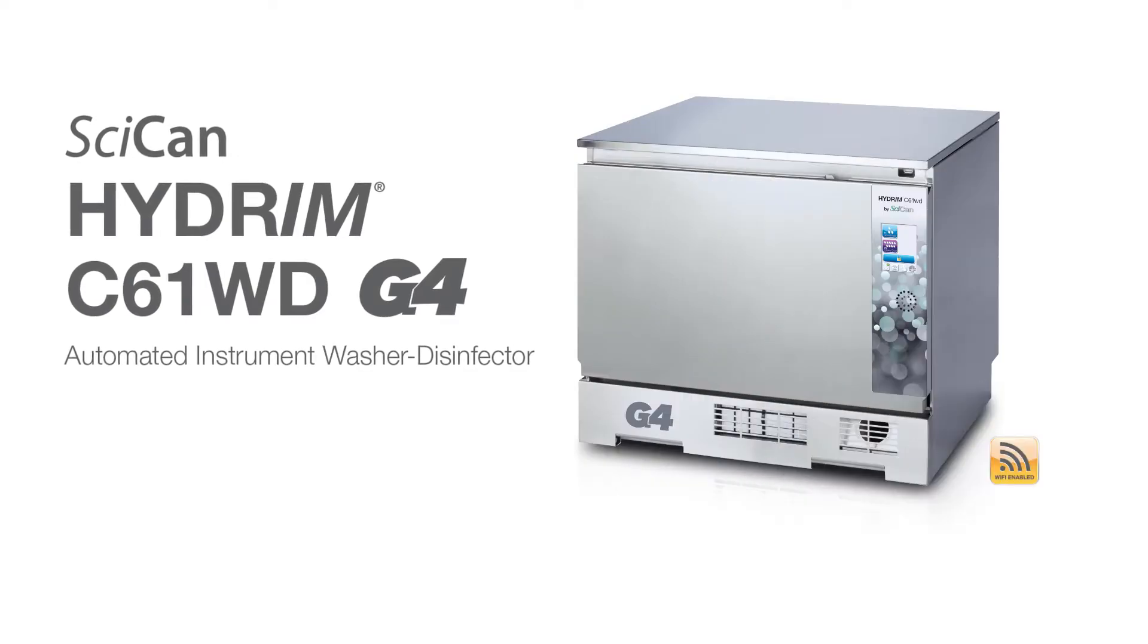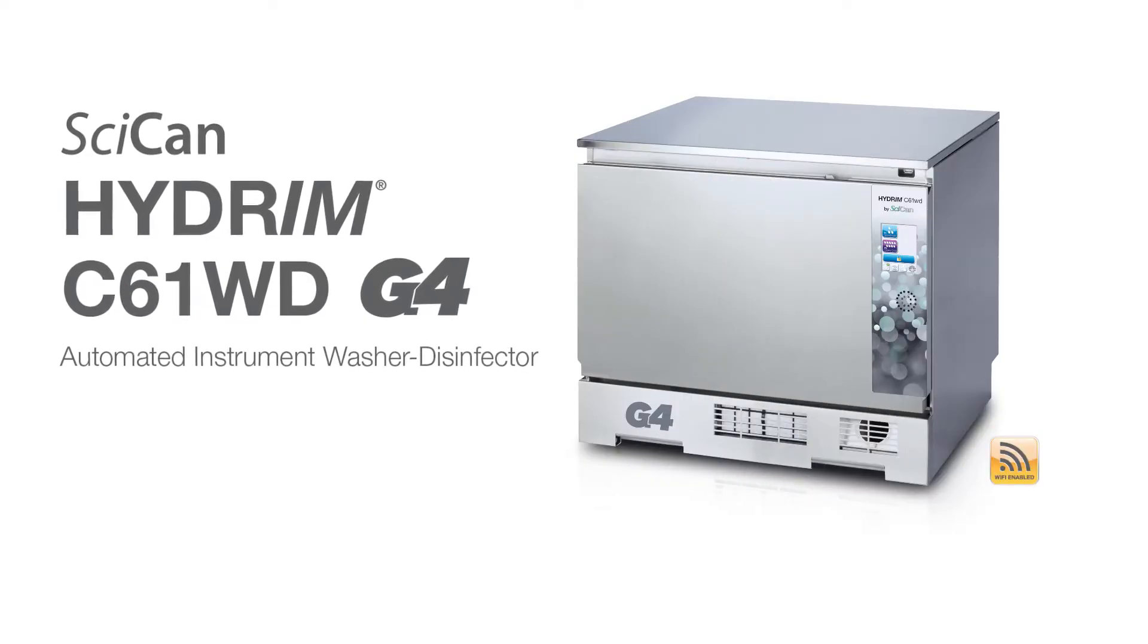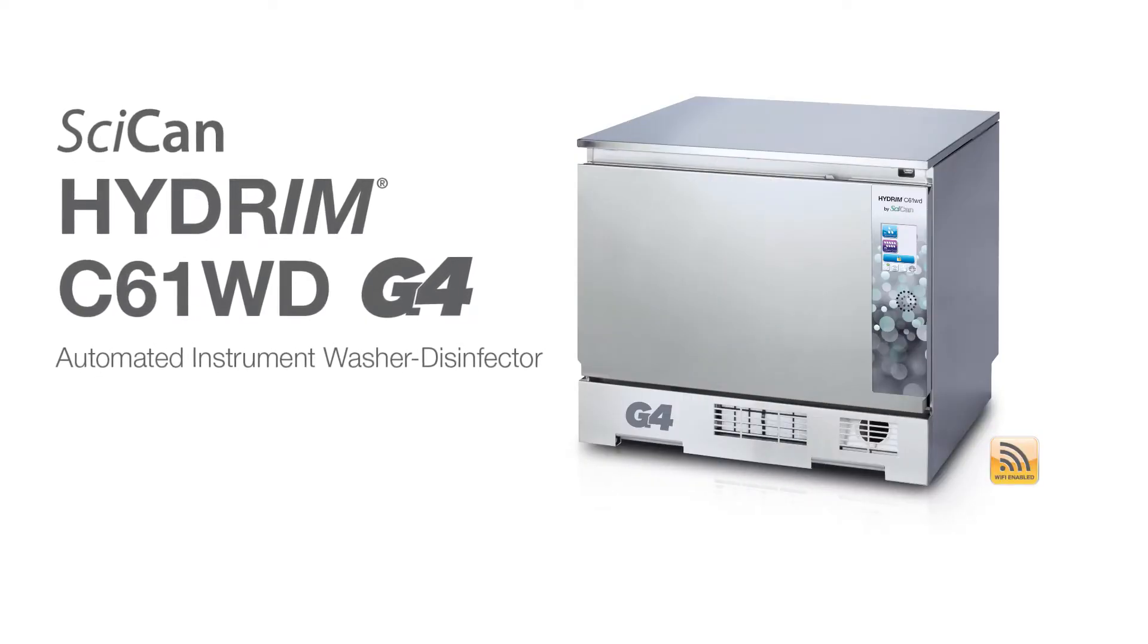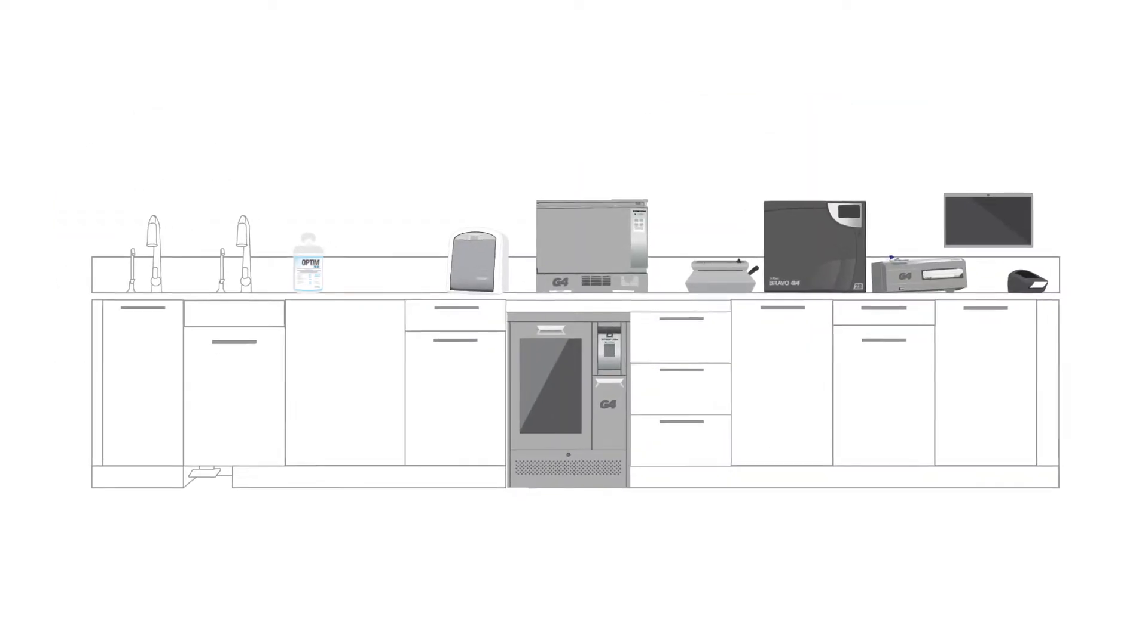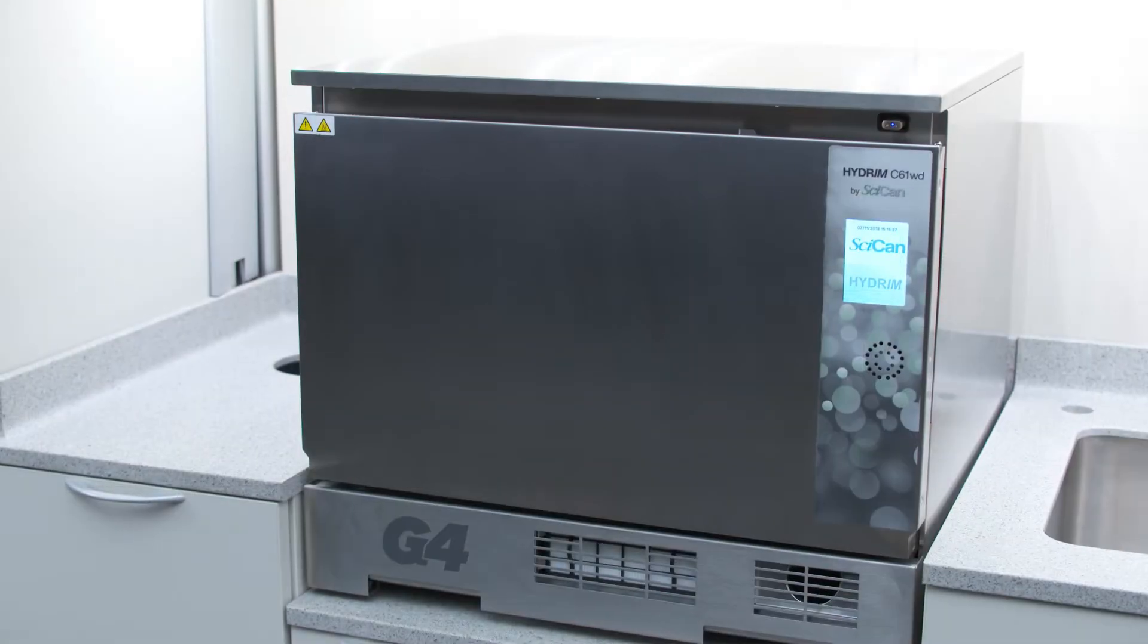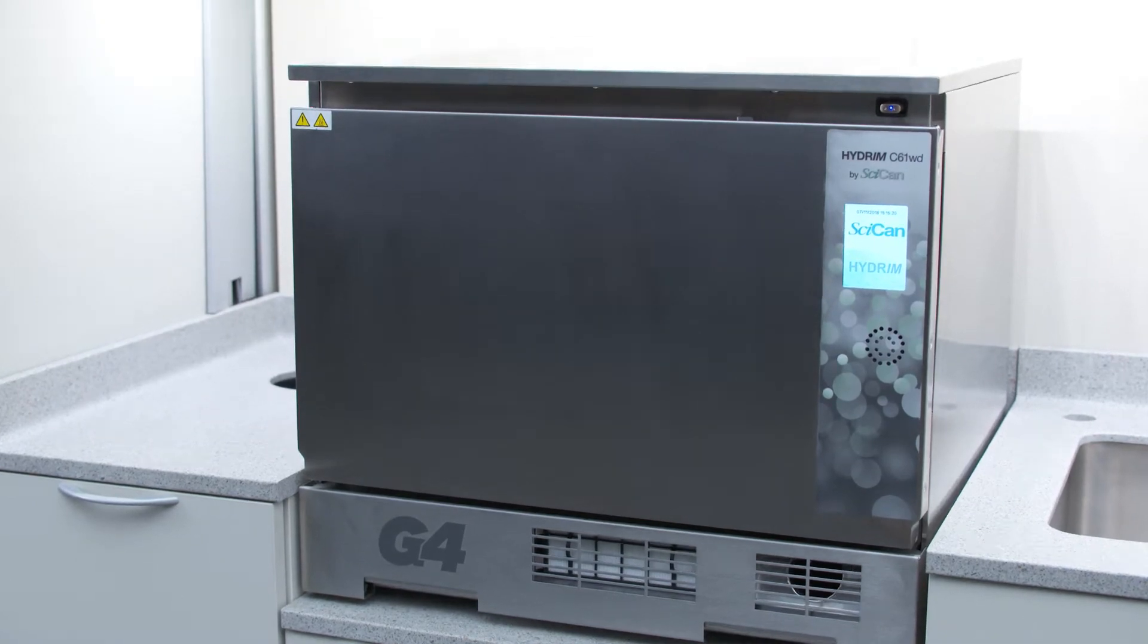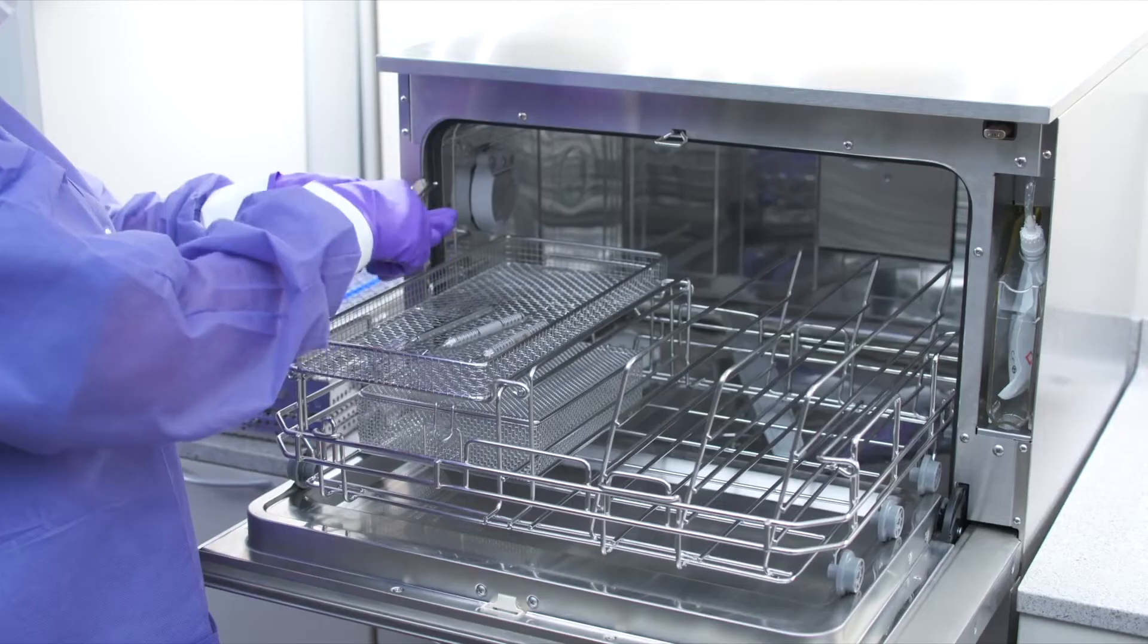Thank you for adding the Hydrum C61wd instrument washer disinfector to your practice. This compact tabletop or under-counter automated instrument washer disinfector with a responsive 3.5 inch touchscreen provides a safe, effective, and efficient way to clean and disinfect instruments.